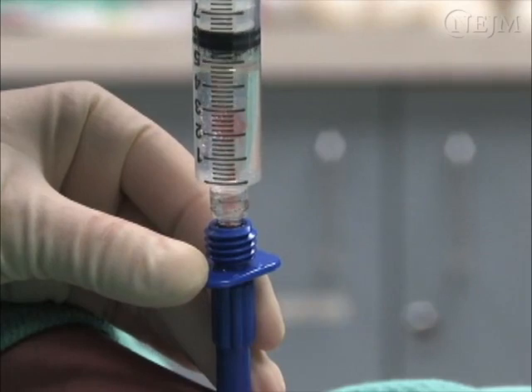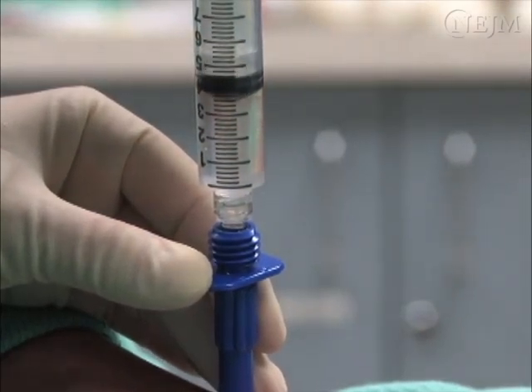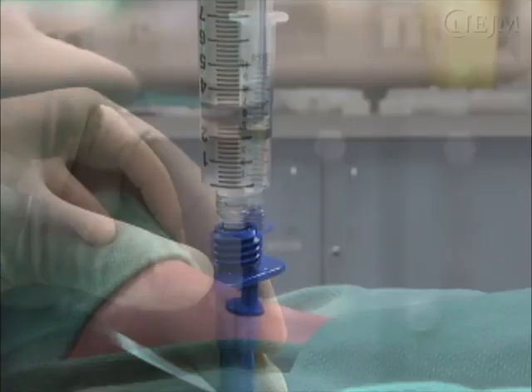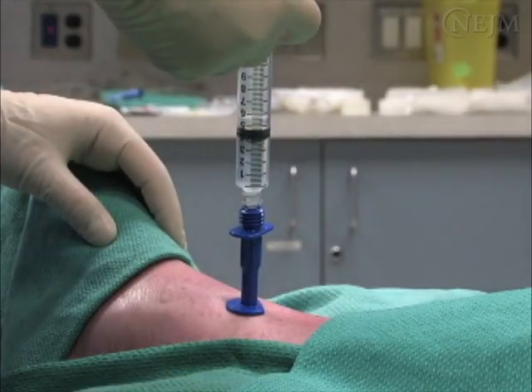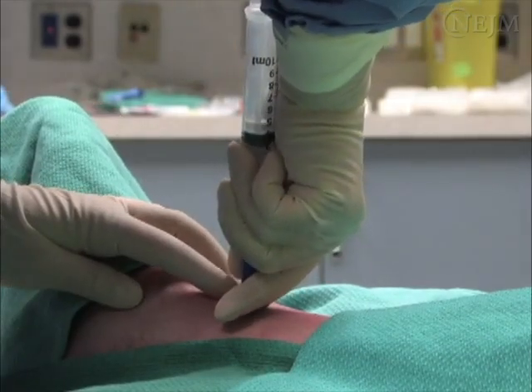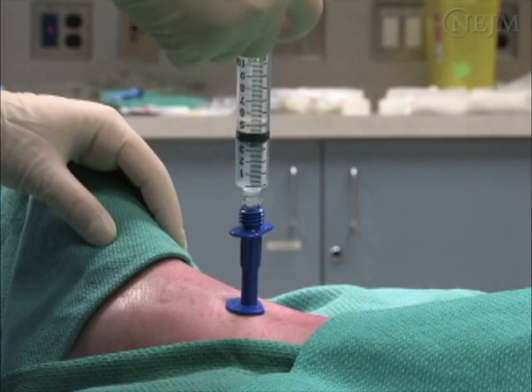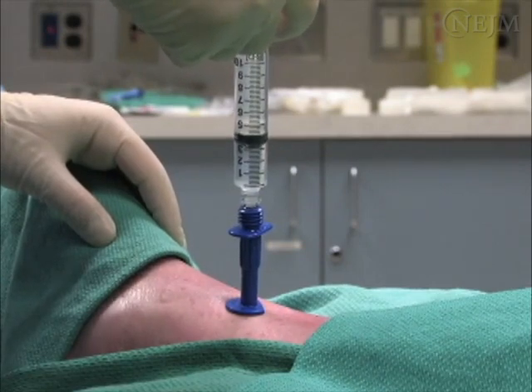Obtain confirmation of placement by infusing a 10 cc bolus of saline solution through the syringe. The fluid should flow easily with no resistance. If the fluid does not flow easily, the needle can be repositioned by pulling back slightly, but if further resistance is encountered, the needle should be removed and a new site selected.